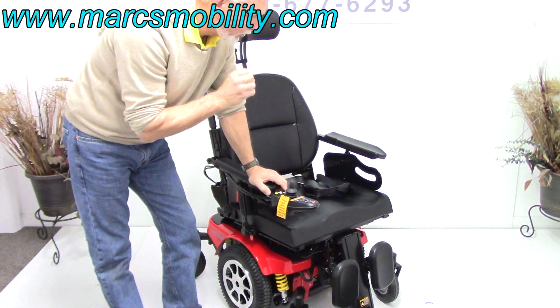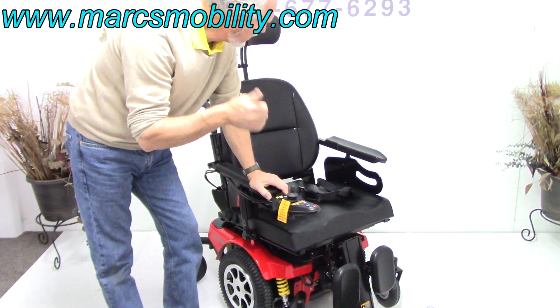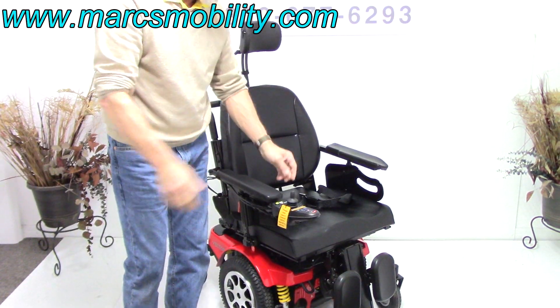This chair has less than two miles on it, so it's in brand new condition. Electric tilt, electric recline, electric legs — ready to go.